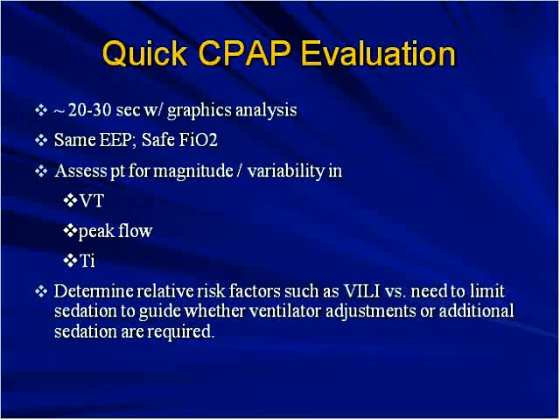This is probably the quickest way, rather than fiddling with 5 or 6 different modes, to assess what is actually going on. So, with this, what is the tidal volume that the patient's trying to pull? What is their peak flow rate? Also, what is their flow profile? And what is the inspiratory time? And how does that relate to what we're trying to deliver with our settings? And also, how much variability?